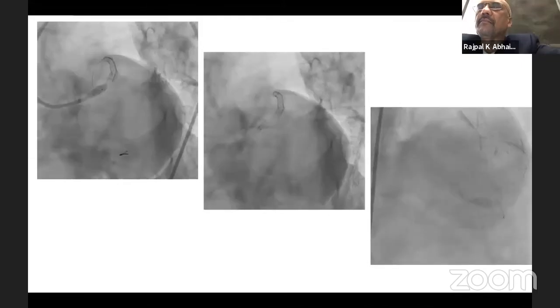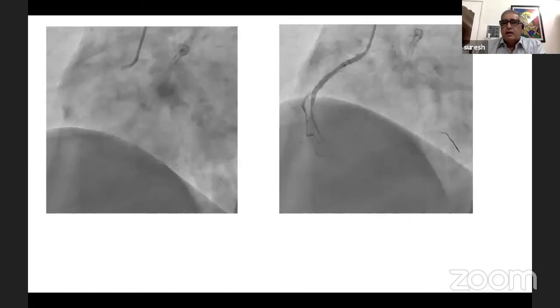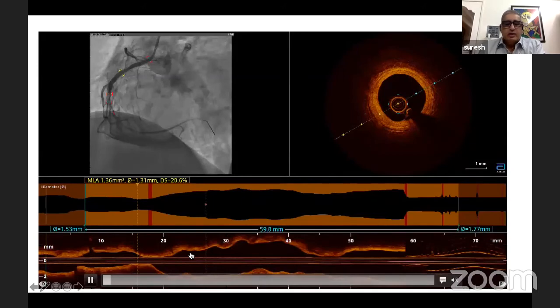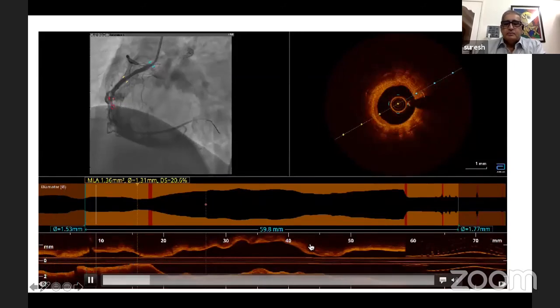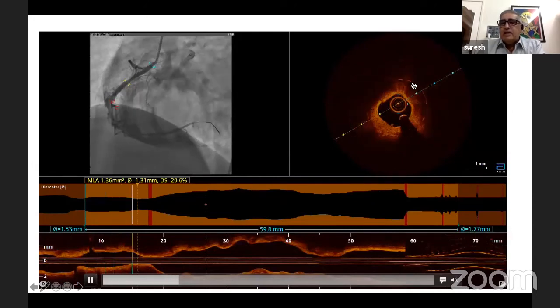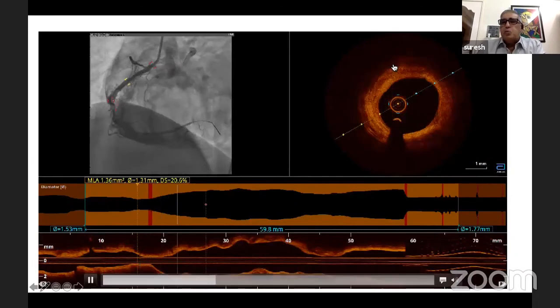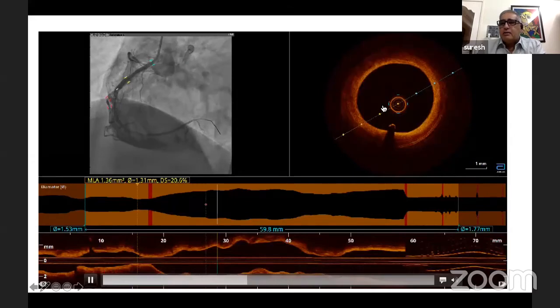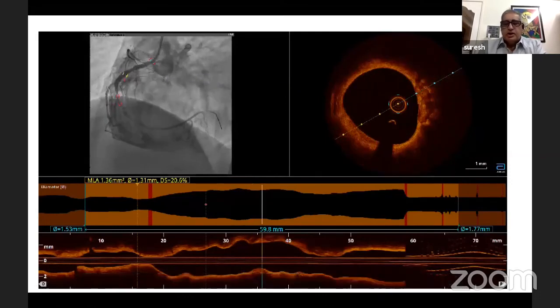Absolutely. Okay, so now we proceed to the right, which is actually very straightforward. Straightforward wiring, OCT to the right again. This is what the right looks like. That's the tightest part of the lesion here, which is fibrocalcium. Again, you can see the stent is the old stent. This bare metal stent, which is 22 years old, is well open, nice size, and there is tissue grown inside the stent with no ruptured plaque. This is not an acute thing at all.